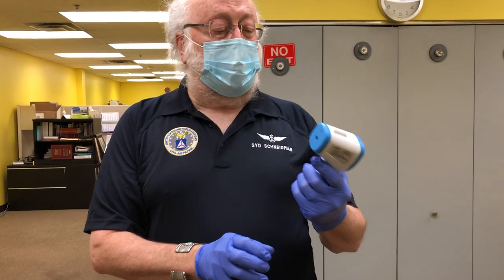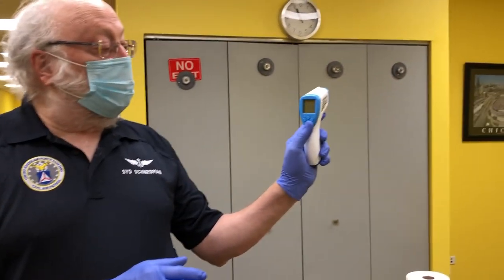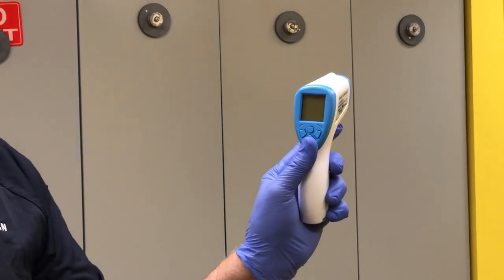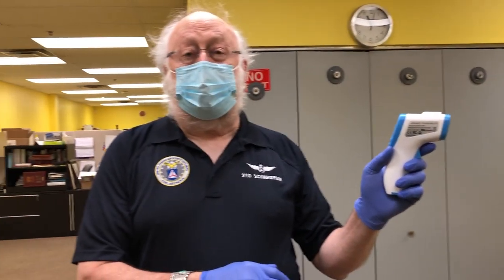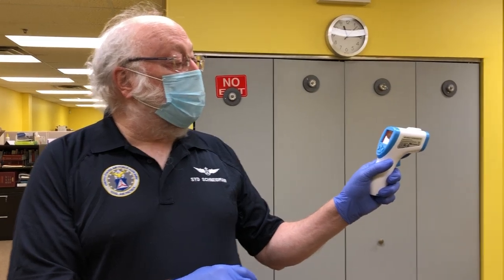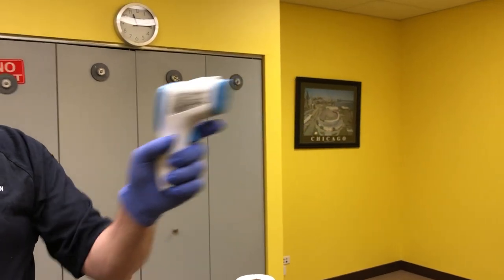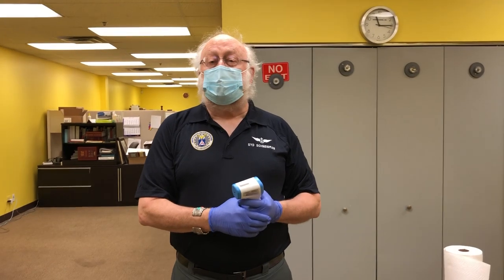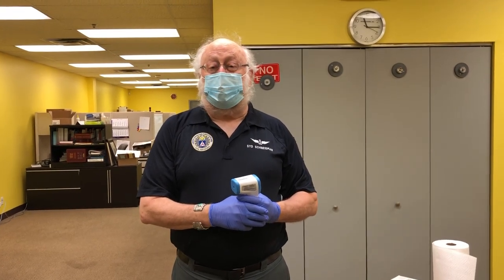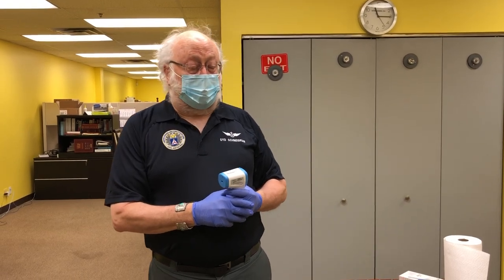It should come up in Fahrenheit. If it comes up in centigrade, you just press and hold the mode button and that changes it from centigrade to Fahrenheit. Many of them will come up in Fahrenheit as is, so it's very simple to work. You pull the trigger once to turn it on, then you move over to your subject and press the trigger again and that takes the temperature. There's also an instruction manual inside the box that you can read if all else fails.